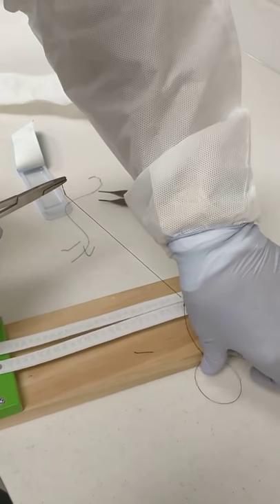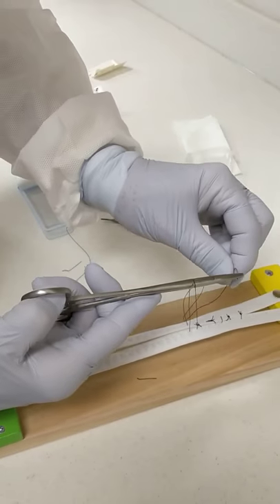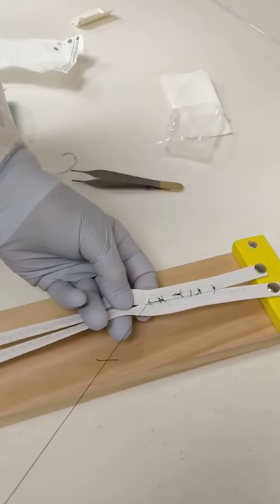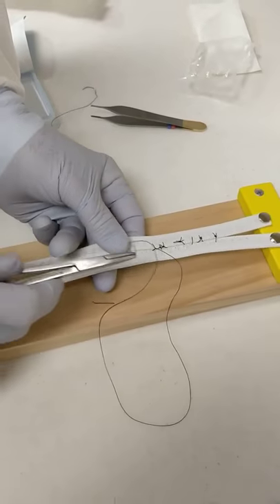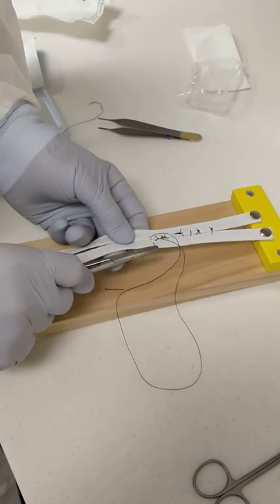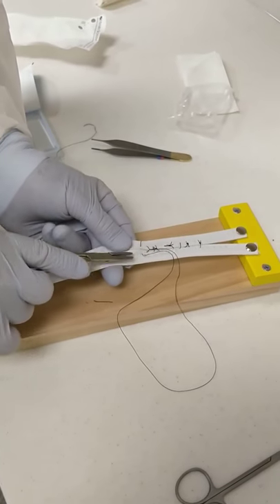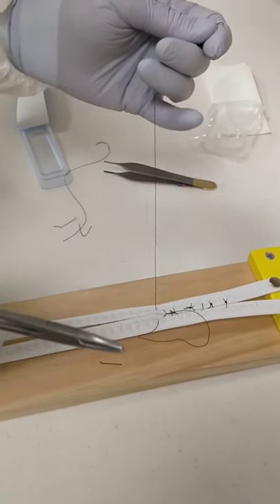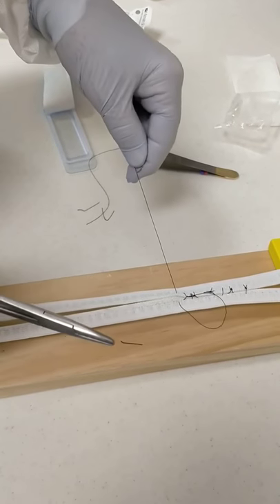And then I go through. Pick this up. Twist it. Go through the back end. Slide that down, it locks and holds in place, and so forth until you come to the end of your incision, then you tie it just the same way you did the other one.